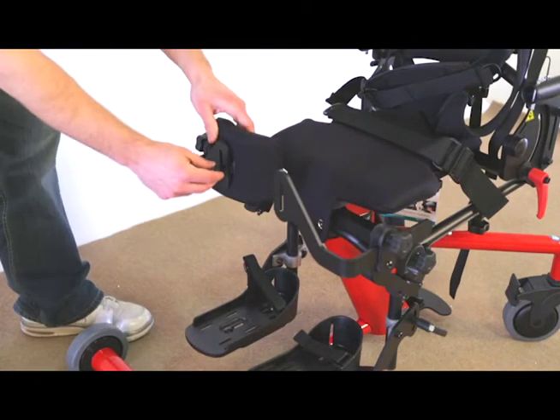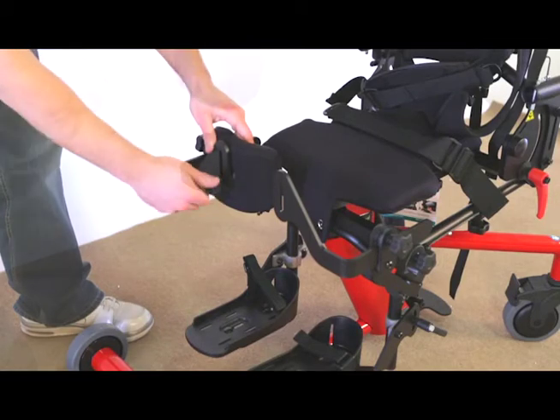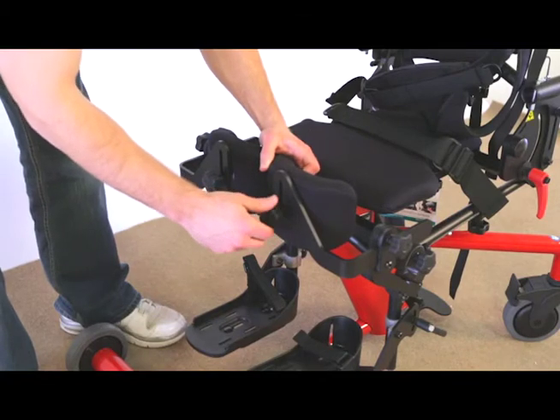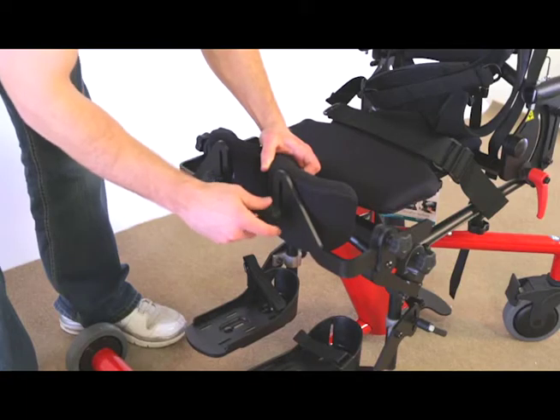Remove knob and metal washer from the knee pad. Leaving the rubber washer in place on the knee pad, place the knee pad and rubber washer onto the knee pad bracket. Place metal washer and knob onto bolt as shown. Repeat steps for the opposite side.